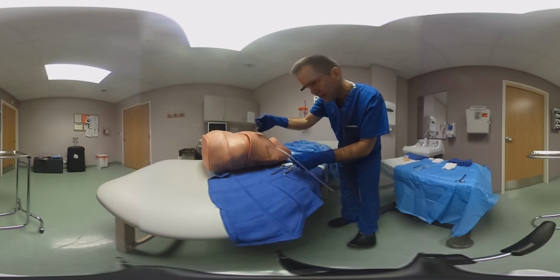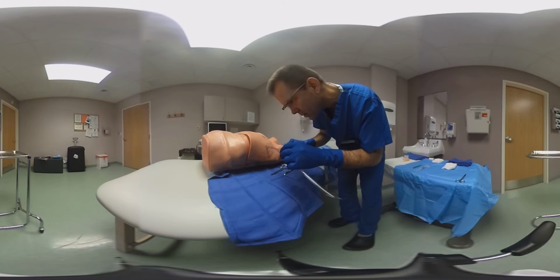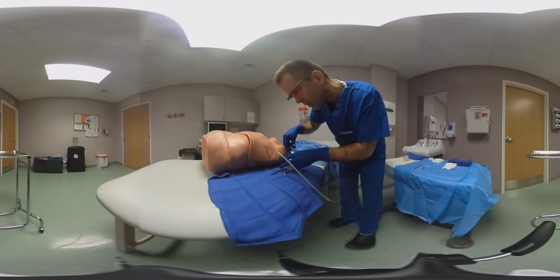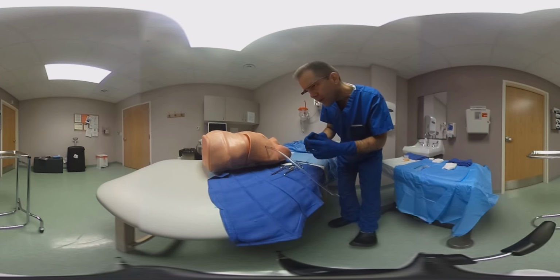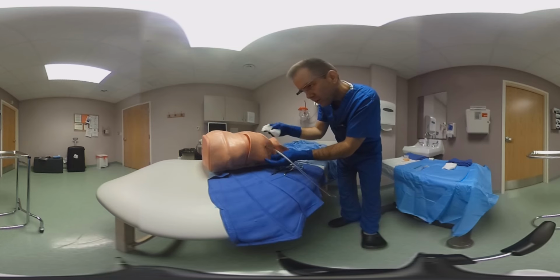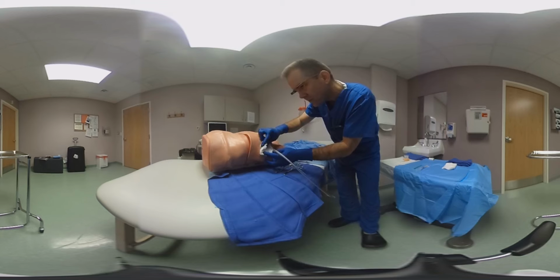Once you do that, you have a very good way to secure the tube so that you can prevent this from dislodging. And then you obviously put some Vaseline gauze around the area to prevent some air leakage, and then a dressing that has to be sterile.